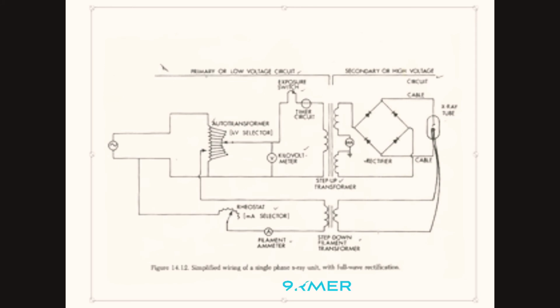After that, we have the step-down transformer, also known as the filament transformer. It is the one that works on mutual induction. So pretty much a step-down transformer contains two coils also, kind of like a step-up, but this time it's going, you guessed it, kind of backwards. The primary coil has more turns, and the secondary coil has fewer, because it decreases.